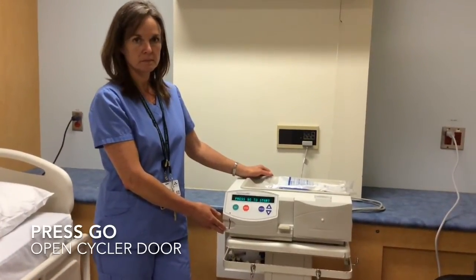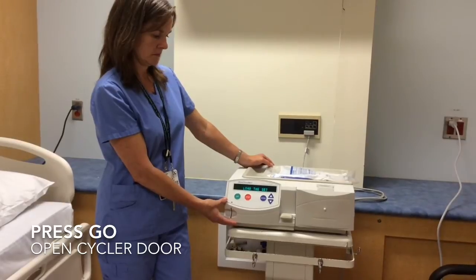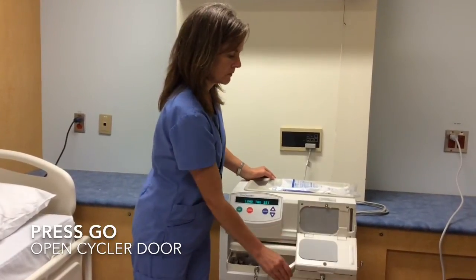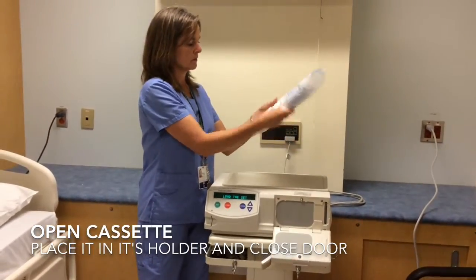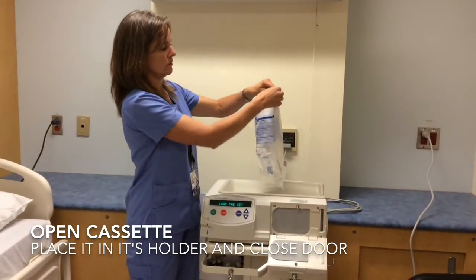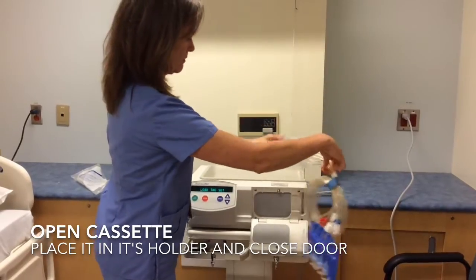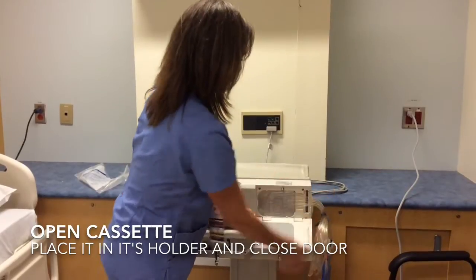After washing your hands, press go on the Cycler. The display will say 'load the set.' You will be able to open the Cycler door. The next step is to inspect the cassette — check the expiration date, open the bag, and place the cassette in its holder inside the door of the Cycler. Then close the door.